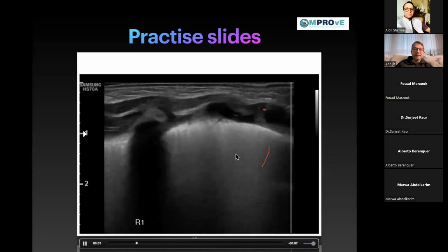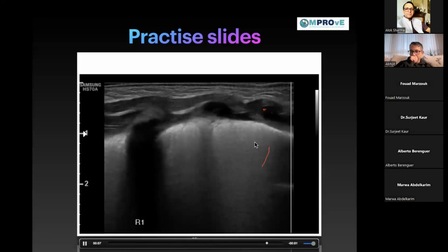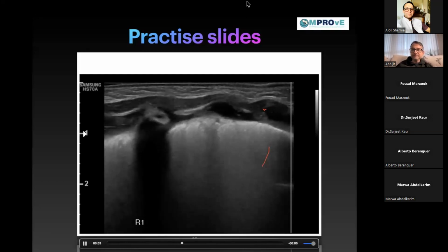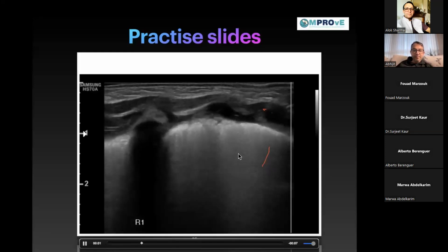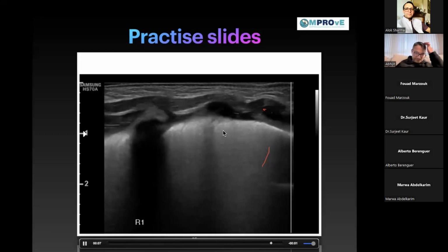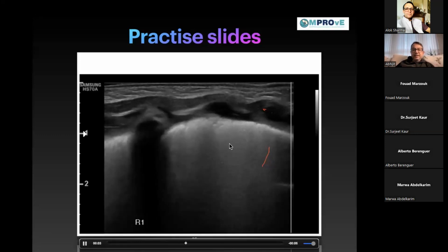Okay, so this is the same baby. I have done the scan at 4 hours of life, and this is the second scan. Baby is on 25% oxygen. Still on 25? Yes. And he's not distressed? He's on CPAP. Maybe we'll wait a little bit. Again, the transitioning lung, because sometimes TTN could take up to 72 hours to resolve. Right.